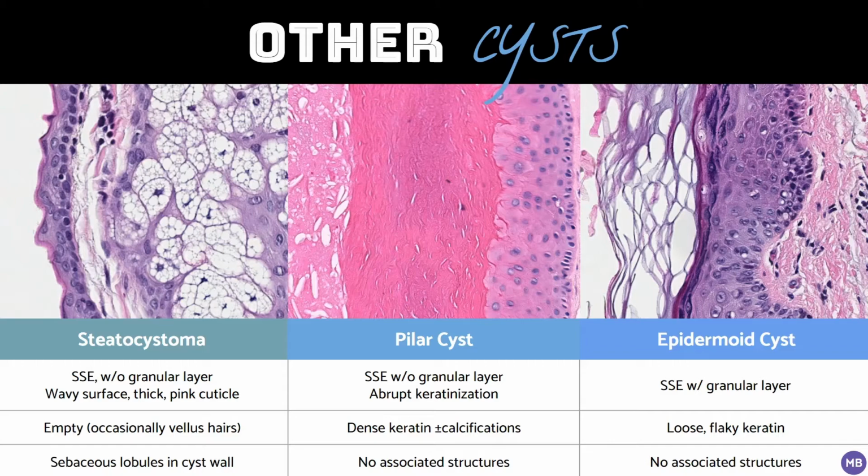Last but not least, we have epidermoid cyst or epidermal inclusion cyst, which I know isn't exotic or exciting, but is probably the most common skin cyst you'll diagnose by far. I'm still in training, so I'm hesitant to give out advice, but I think my one piece of advice for residents regarding these lesions is that if you're thinking of diagnosing something cool or exotic, like a dilated pore of Winer or a pilar sheath acanthoma to impress your attending, it's probably to your benefit to include epidermal inclusion cyst on your differential, unless you see something that really raises your suspicion for another lesion.